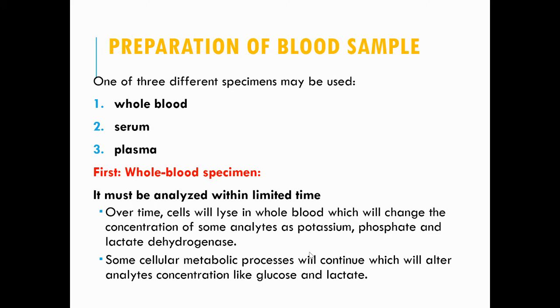It should be analyzed within limited time because through time, the cells will lyse in the whole blood sample, which will affect the concentration of our potassium, of our phosphate, and our LDH or lactate dehydrogenase. Some metabolic processes also continue, and it will alter the concentration of our sugars like glucose and lactate.